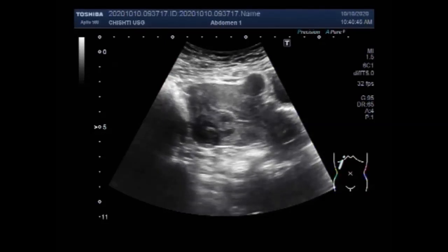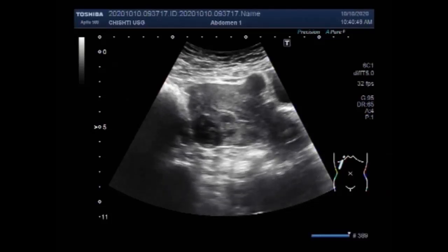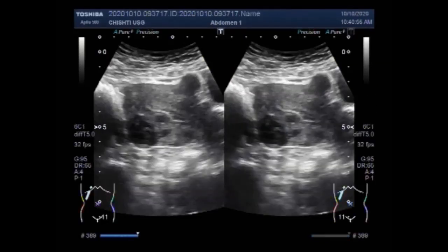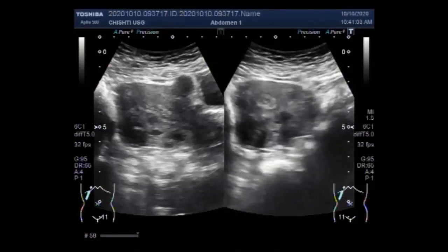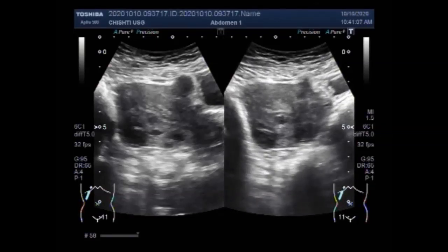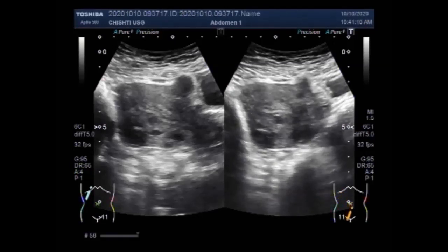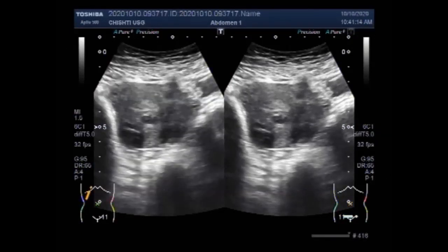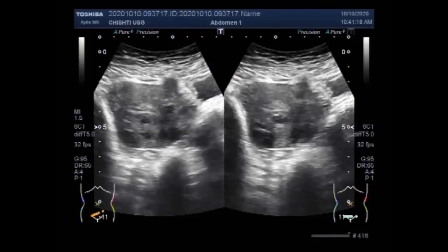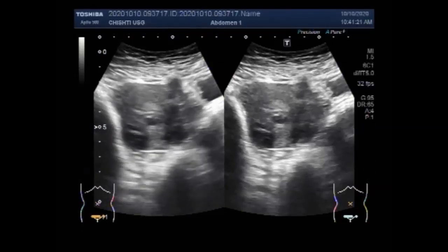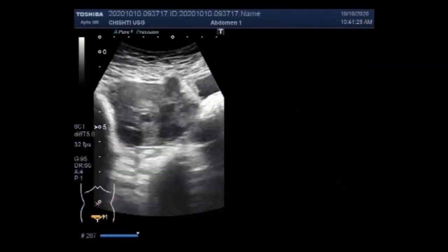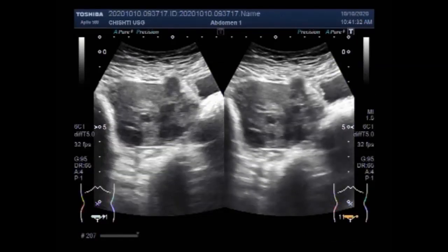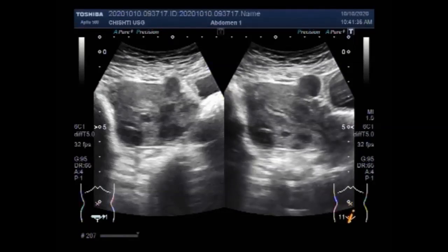There are many types of fibroids, and the type depends on its location on the uterus. Intramural fibroids are the most common type; they appear within the muscular wall of the uterus and may grow large enough to distort the uterus. Subserosal fibroids form on the outside of the uterus, called the serosa, and may develop large enough to make the uterus appear bigger on one side.